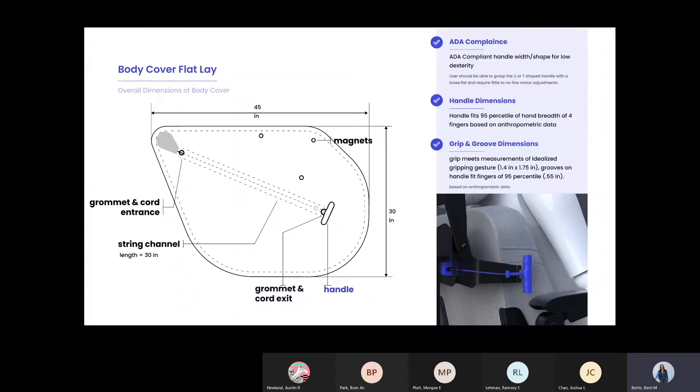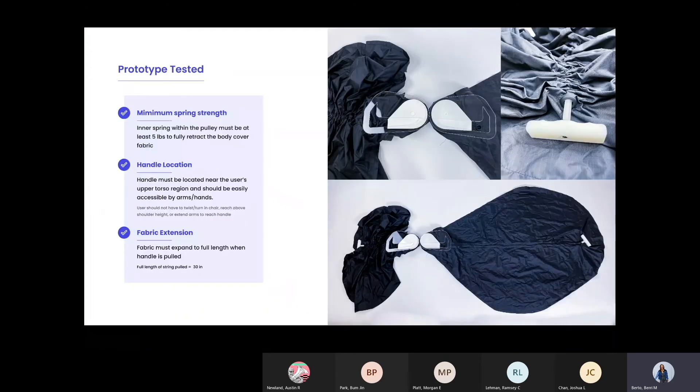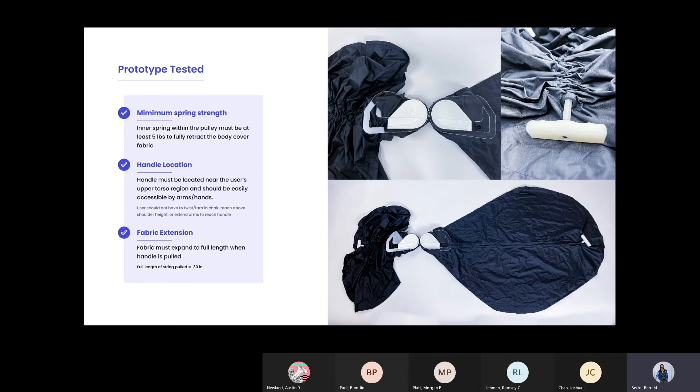Here you see the magnets in three locations to secure both sides, and you can see the handle location that sits on the side. Here is our prototype that we tested with. We also created the physical prototype in order to determine the feasibility and functionality of the body covering.